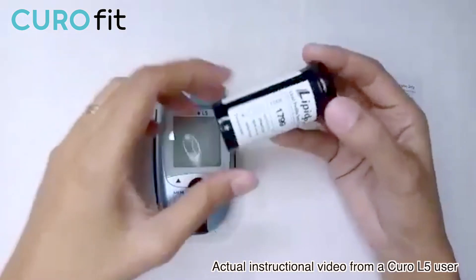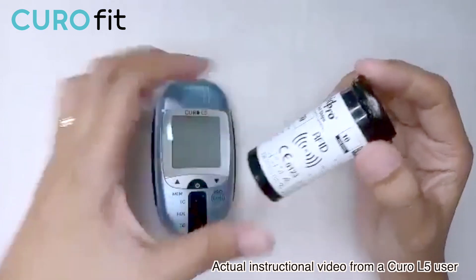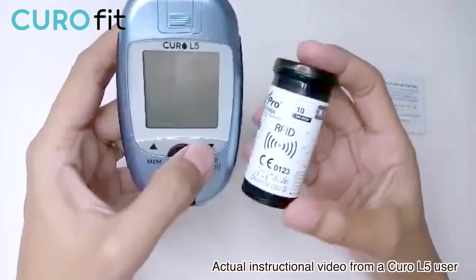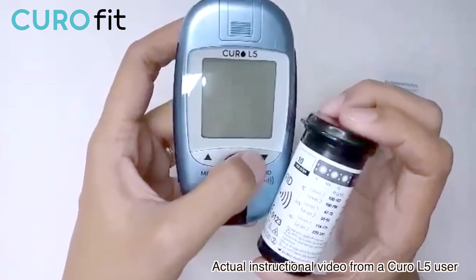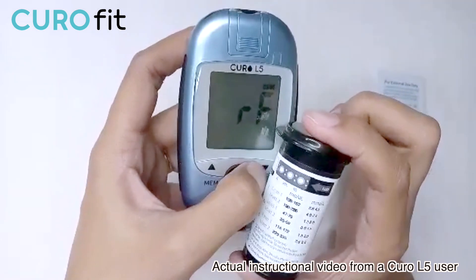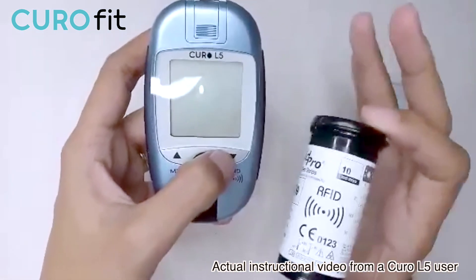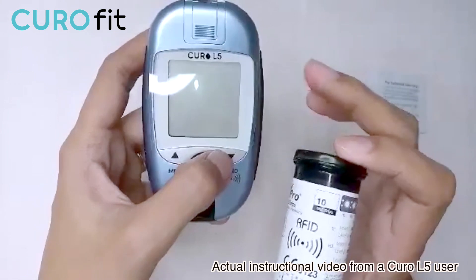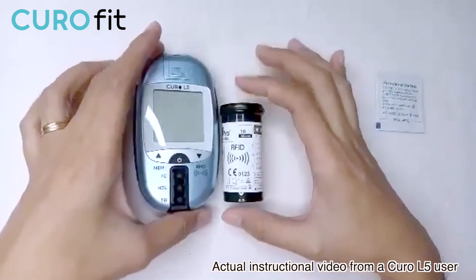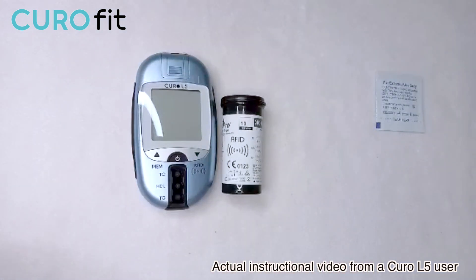Before testing, let me code the device. Each vial of test strips has an RFID tag. To code the device, hold down the down arrow for three seconds. 'Code RF' will be displayed on the screen. Then place the RFID tag on the strip vial next to the RFID symbol on the bottle. The code 1799 shows on the device. Once you hear the beep sound, it means the device recognizes the RFID code. Every time you purchase a new vial, you have to code the device, but you only have to do it once per vial.